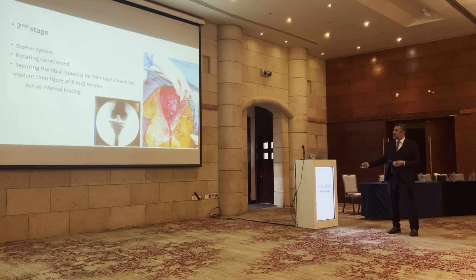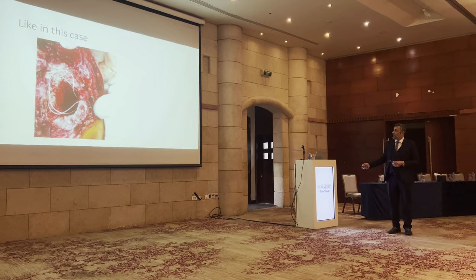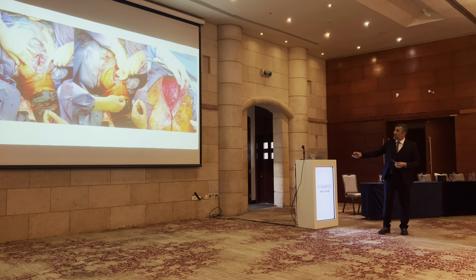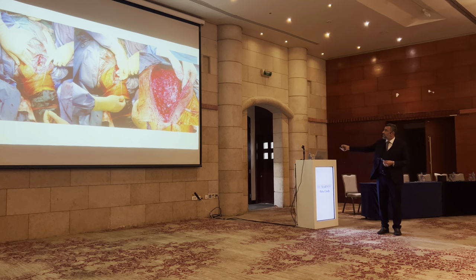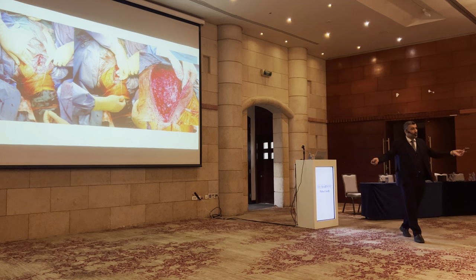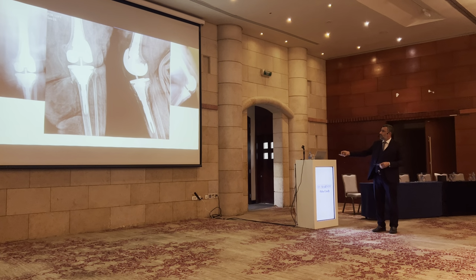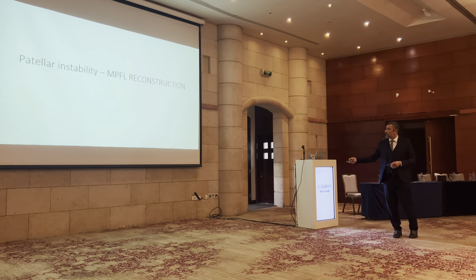What to do during the revision surgery? We did the same technique. This is from the previous patient but I show you the same technique, and we pass the sutures from behind, suture the patellar tendon and put a figure of eight to the quadriceps tendon. So the tibia is safe and we were not worried about the motion. You see how thin it is? But it's protected. So internal technique.